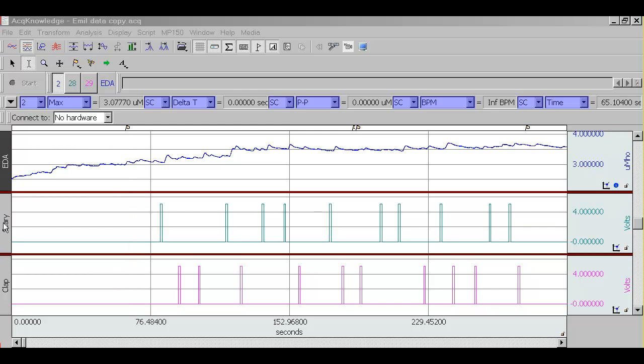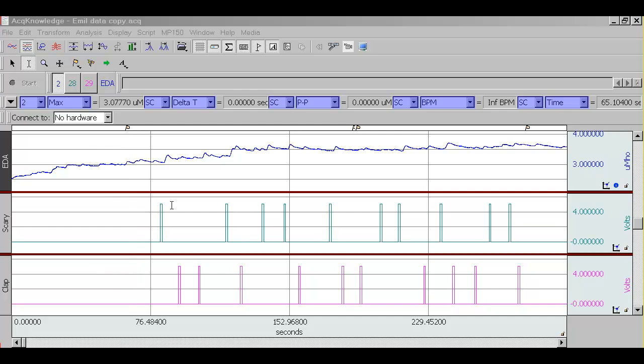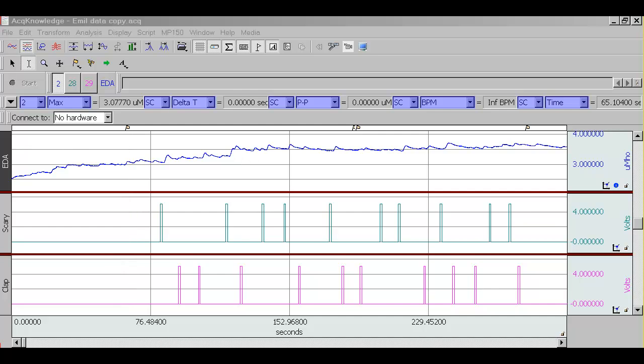In this particular example, we have two channels of digital marker data. One corresponds to stimuli that were categorized as scary, and the other channel corresponds to clap sounds. In this experiment, two different types of sounds were played to the participant, and we're looking at the skin conductance responses following these sounds.